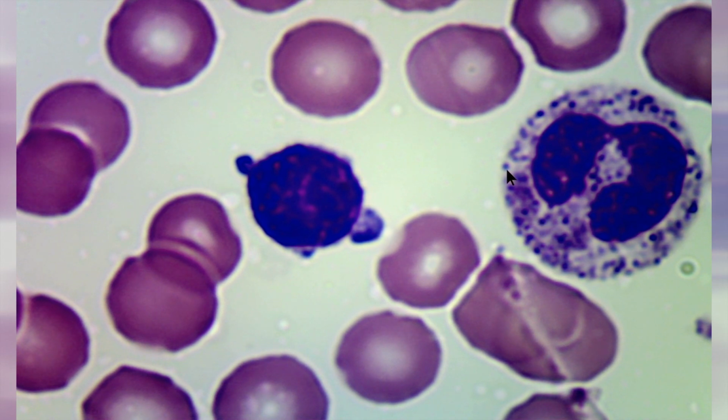In the neutrophil, you can see the cell is larger. There are primary granules present. And again, these neutrophils in here indicate the presence of toxic granulation, which you quite often may observe in the case of infections. And with the appearance of the monocytes in this slide, as well as the appearance of the toxic granulations, I do suspect that this patient is dealing with some sort of infection.